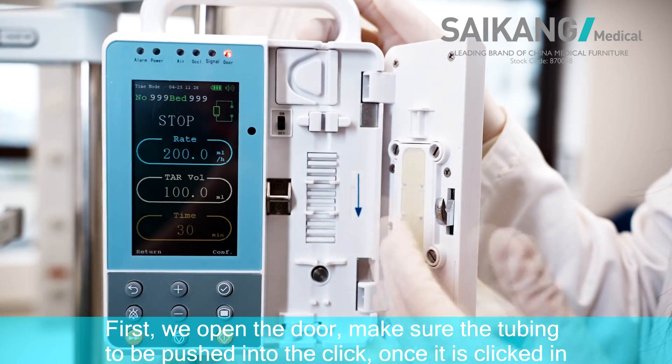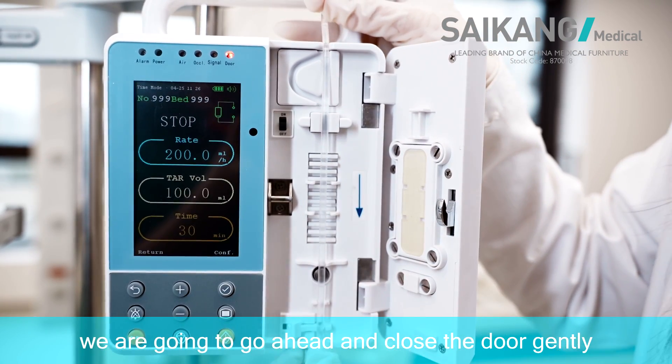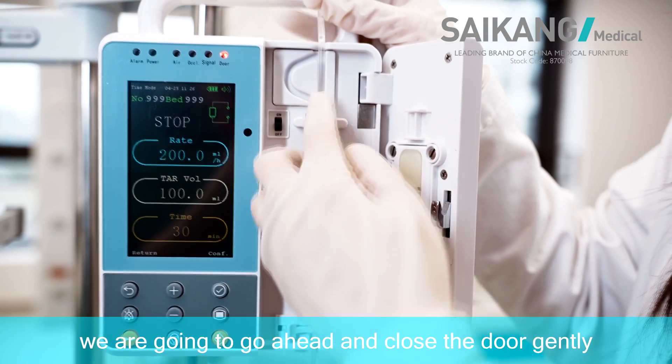First, we open the door and make sure the tubing is pushed in to the click. Once it is clicked in, we go ahead and close the door gently.